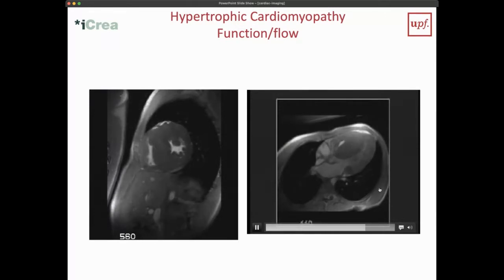So we know that in MRI imaging, we first locally flip the angles of the protons, and then we look at the dynamic recovery of these. So what happens is if we have very, very high blood velocities, then obviously the spins that we had flipped move out immediately. And so that's what you see.